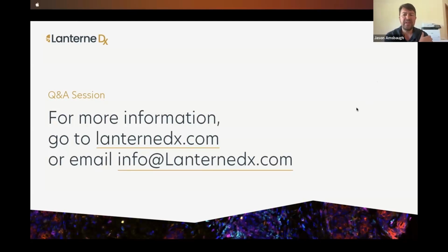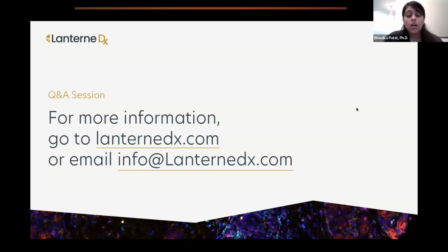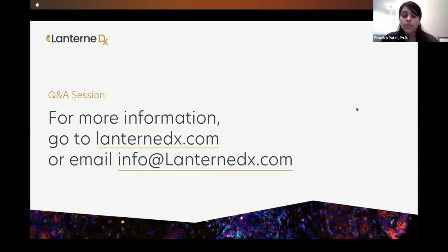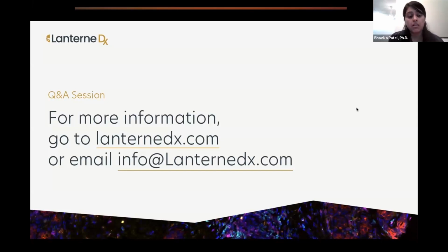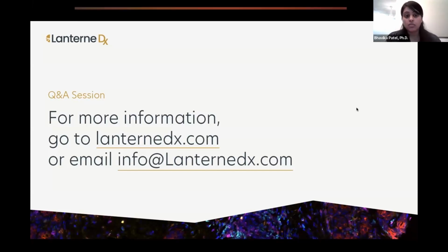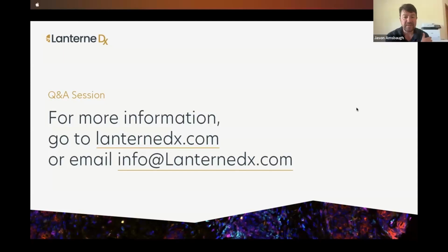Have you had good results or any issues using frozen mouse brain tissues for multiplex assays? So OCT samples are a little bit more difficult for multiplexing because the epitopes may be damaged in the process. We have used FFPE mouse samples for multiplexing from, I think, between 4 to 5 plex assays. So we have used mouse tissues. Brain, we have one panel that we worked with Akoya on, and that one we do have some good results as well. Perfect, thank you.